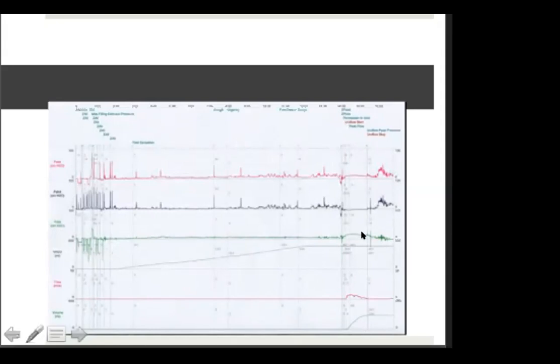So that's 288 ml, and then there is 70. So upon computation, the contractility index was 70. So it signifies a detrusor muscle underactivity. So 30 plus 5 times 8. So kaya 70 siya.